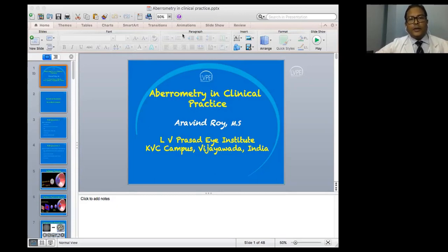Change during pregnancy, would you mean the aberrometry or the topography by this change during pregnancy? Topography would definitely change during pregnancy due to the effect of the hormones, and it also reverts back to normal about 6 to 8 months after nursing.